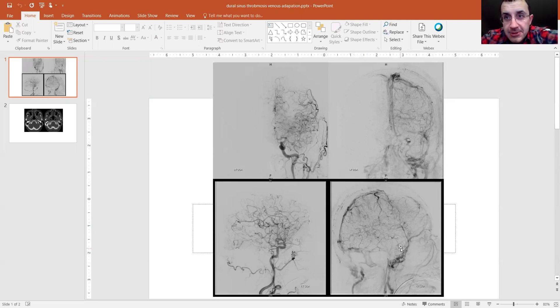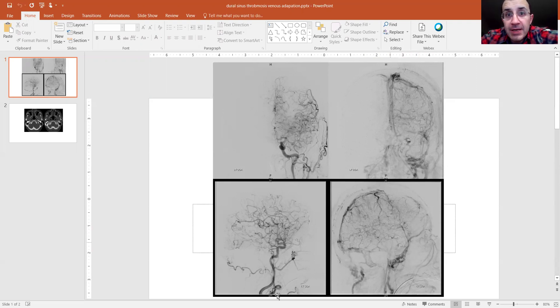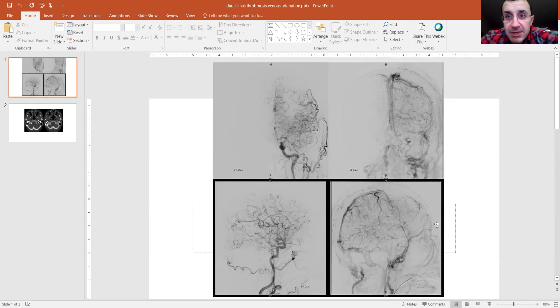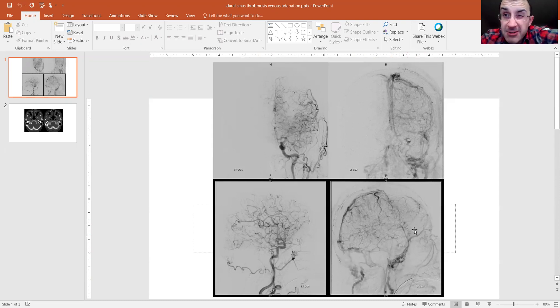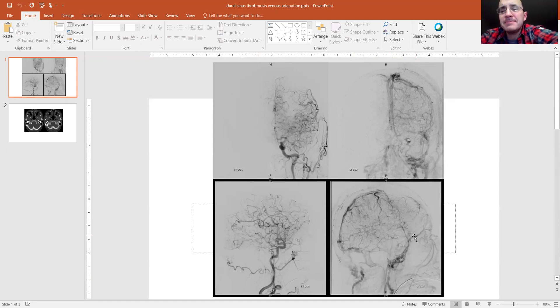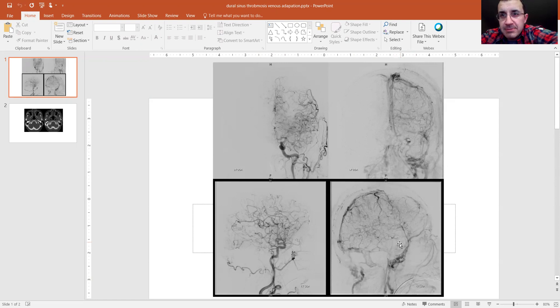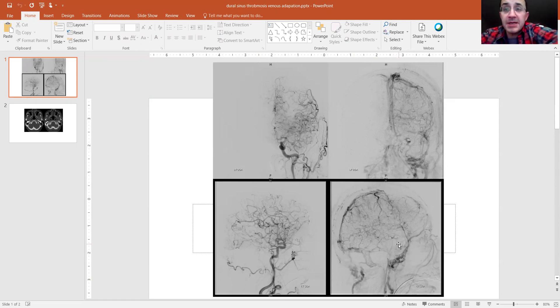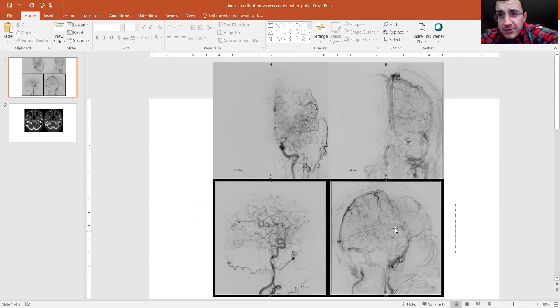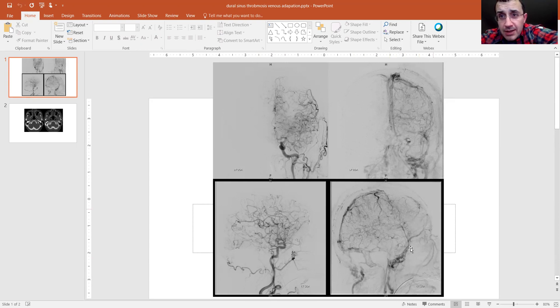And then here, you also see the superior ophthalmic vein. Now that's a common injection. So sometimes you see that just normally from common drainage. But in this particular case, there's a retrograde flow via this vein out because the superior ophthalmic vein is also a nice big conduit that can reverse flow. There's a little bit higher pressure, obviously, in the head, but she's tolerating it well. And that can be reversed and that can drain via these angular veins and whatever into the face and then help out as well.